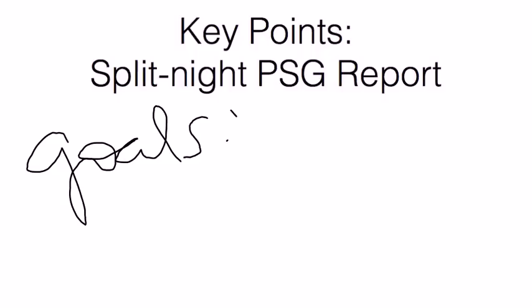For further details on CPAP titration, please refer to the talk on key points for CPAP titration. And for other points regarding the actual diagnostic portion as well, you can refer to key points for an adult baseline PSG report or sleep study report. So the goals, like I mentioned as well, is not only to make an adequate diagnosis, but also find an optimal pressure, wherein the AHI for that patient is reduced to less than 5 ideally.